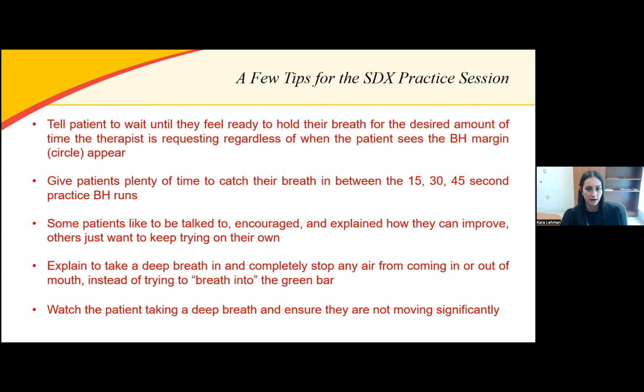So obviously this is still radiation therapy and you still don't want your patient to move. After you take your images, it would not be conducive to what you're trying to do during treatment if your patient was moving slightly out of position every time they take a deep breath in and hold right before the beam turns on. So in order to make sure that the patient's a good SDX candidate, make sure that they're holding pretty still when they take their deep breath in and hold.